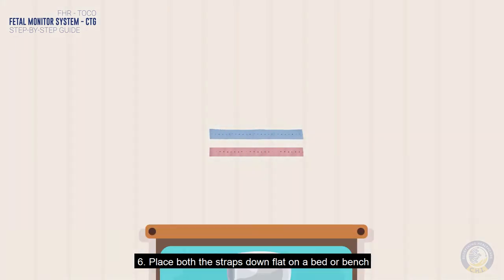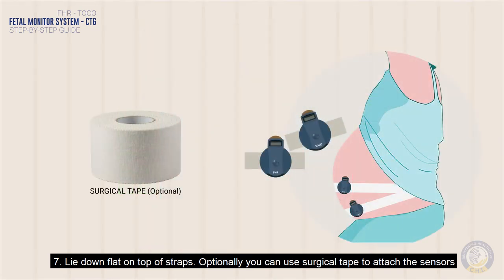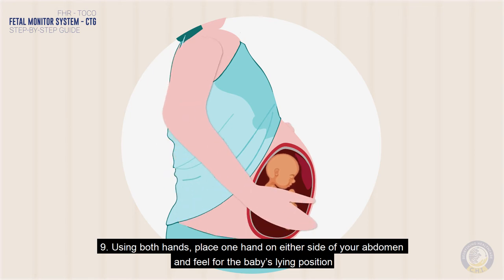Place both straps down flat on a bed or bench and lie down flat on top of the straps. Optionally, you can use surgical tape to attach the sensors. The side of your abdomen where you are feeling the baby kicking is likely where the feet are.